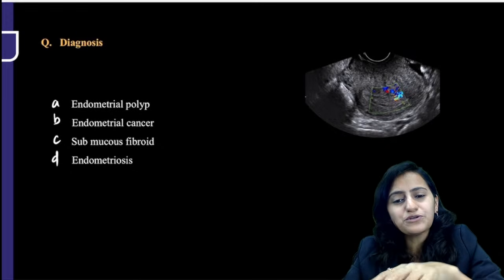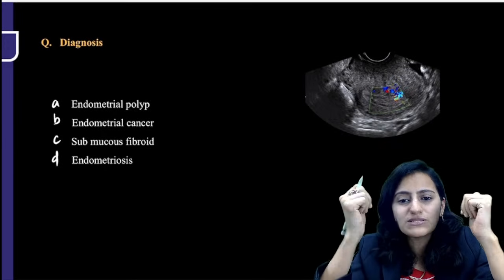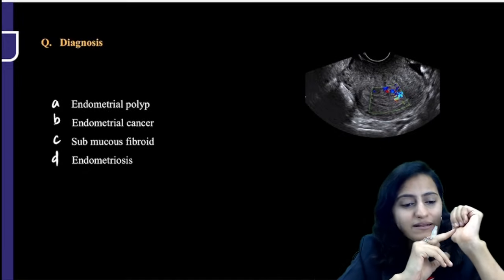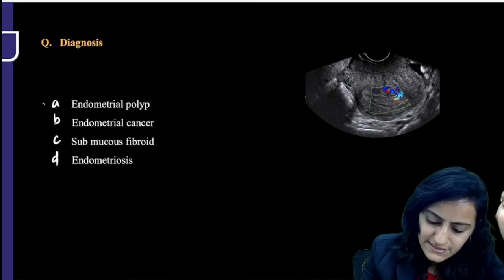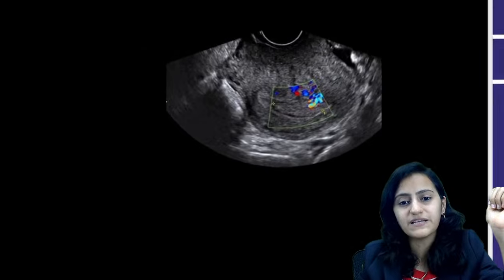Dharmendra, the arcuate uterus is just a small fundal indentation, which is almost like a normal uterus. We don't need to do anything for arcuate. Right, this is the endometrial polyp. Again, this is a previously asked question in one of the exams.